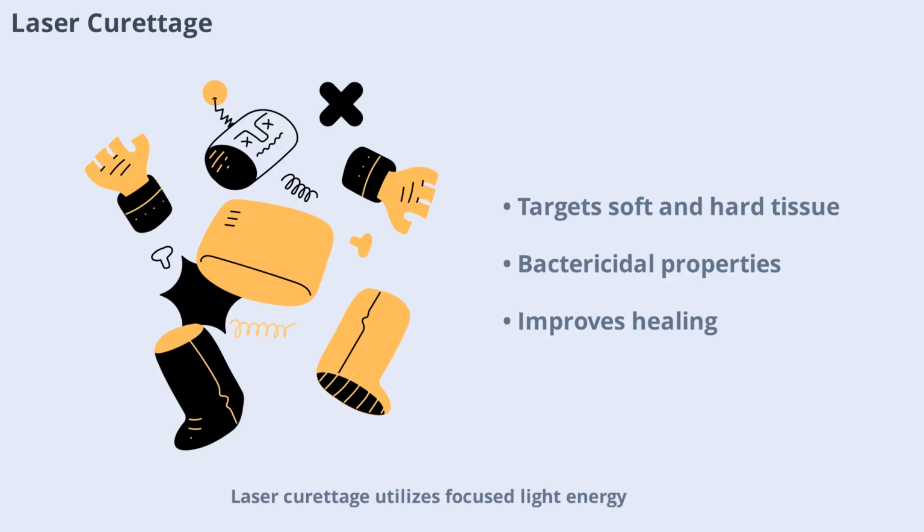Laser curettage utilizes focused light energy to target both soft and hard tissues. The bactericidal and detoxification properties of lasers help remove the epithelial lining and improve healing, especially in moderate or inaccessible periodontal pockets. Laser technology offers precision and enhanced patient comfort, making it a valuable tool in periodontal therapy.